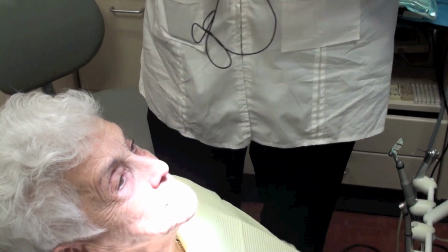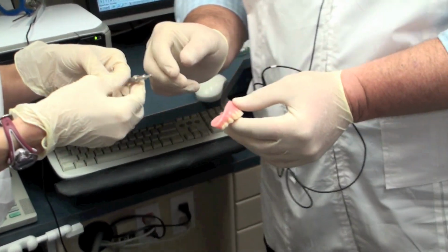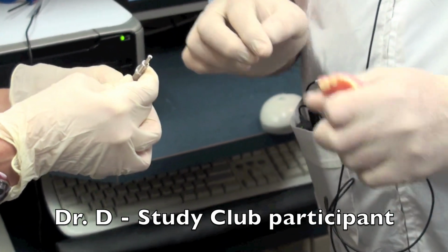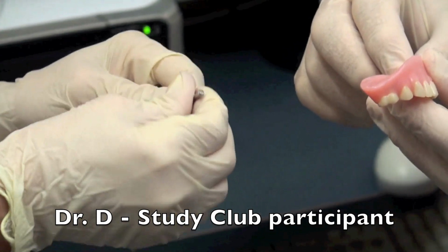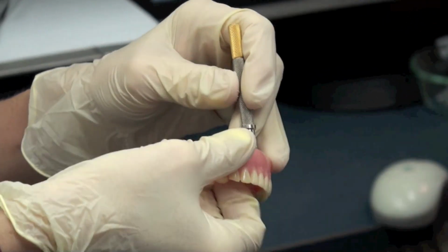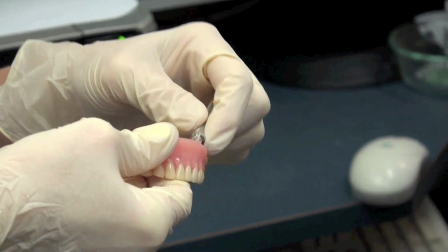Yeah. Screw it back 3 turns, right? Yeah, so you just take it back 3 turns. 2, 3. You see how this part is going to go inside? Oh, so 3 big turns. Yeah. Okay. You can even tap it. Okay, perfect. So you turn it back 3 turns, and then insert it all the way in fully, and have it flat to the bottom, and then pull it back out. Pull so it's straight.